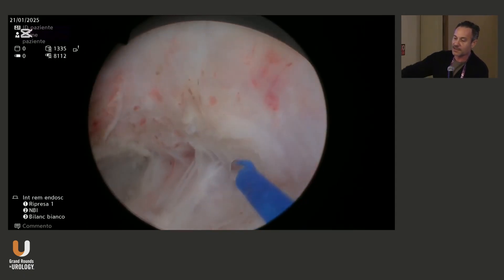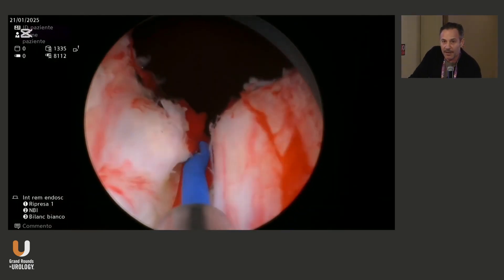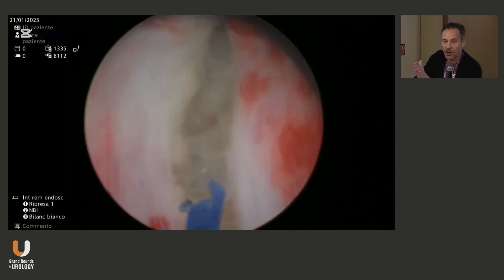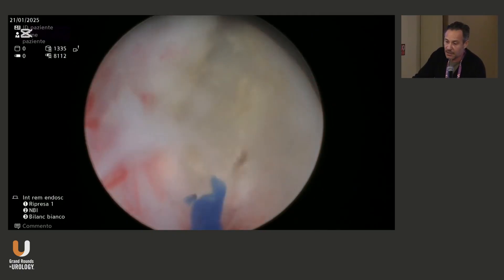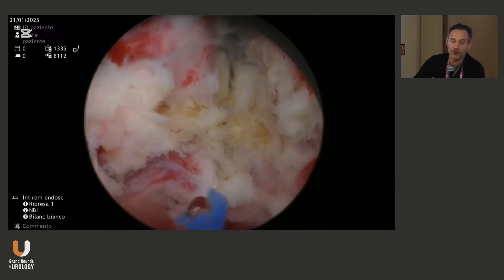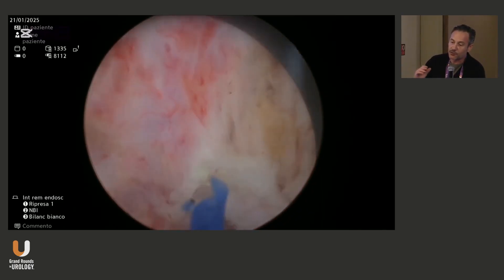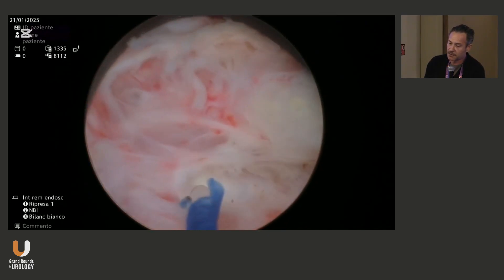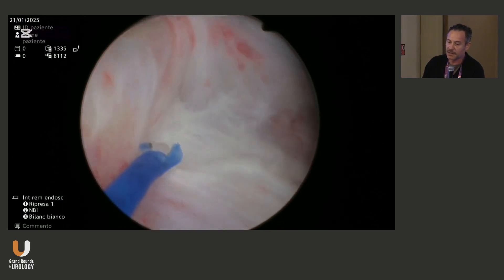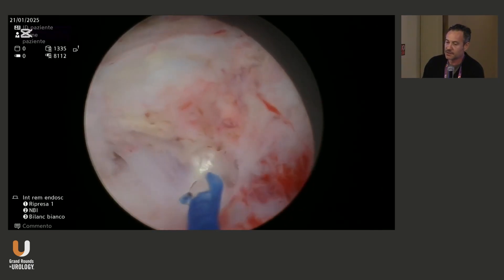We are going counterclockwise on the left side. I help myself with just small coagulations. Then when the apex is pretty clear, I go back to the bladder neck. I already know where the right plane is at the apex, so I make my six o'clock incision — I know where to stop because the posterior plane is already clear. Then I go back and forward trying to identify the plane with gentle traction with the instrument, just coagulating, nothing more than this.